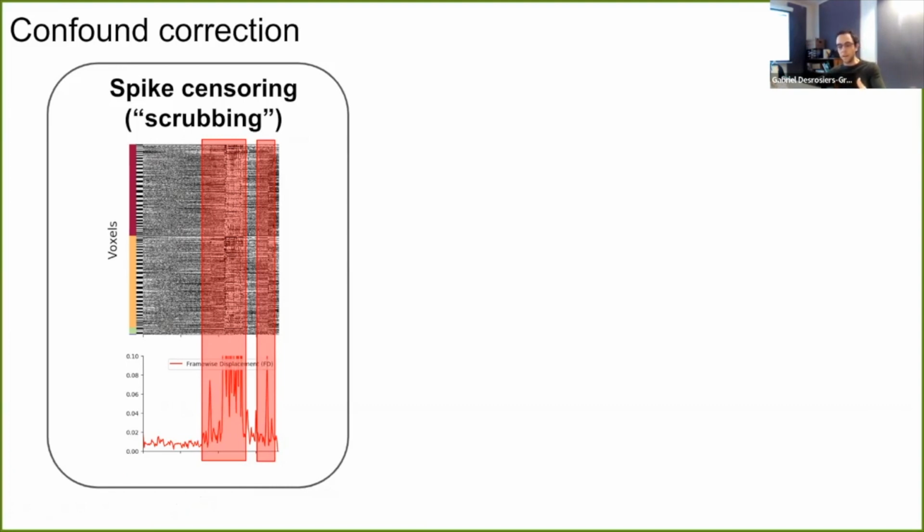This is partly because, as some of these papers have documented, we unfortunately can't completely correct the motion in some of the very highly corrupted frames. So that's a very good solution that I recommend using if you have high levels of motion.